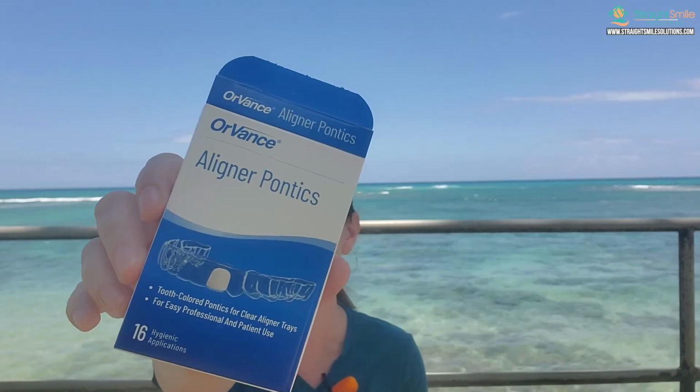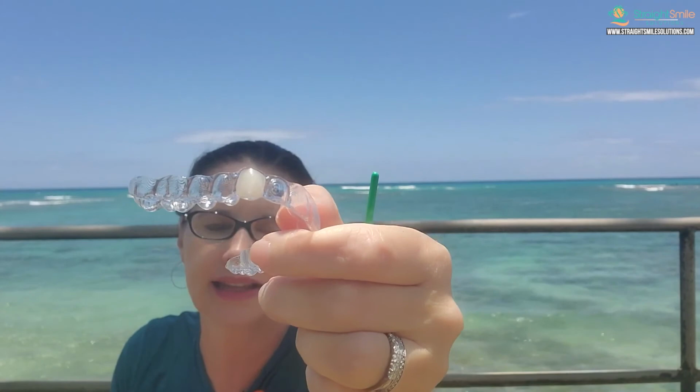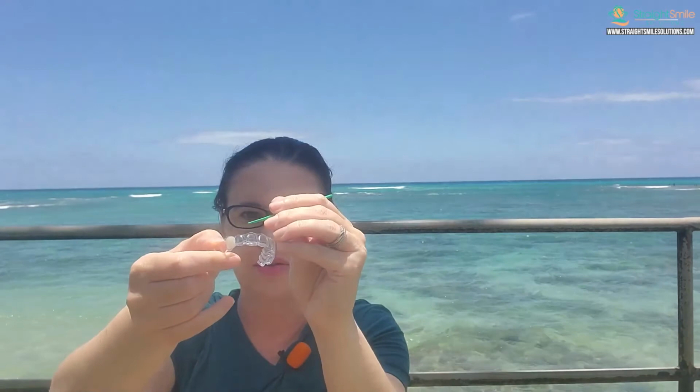If you've ever seen my other videos about how to make a pontic, I was actually pleasantly surprised how incredibly aesthetic this is. All you're going to do is just open up the pouch, shove it in, almost like it's wax. Use a micro brush to adapt it nicely at the gingival. You want to try it in the patient's mouth just to make sure it's not impinging at all. But it's really actually quite easy.